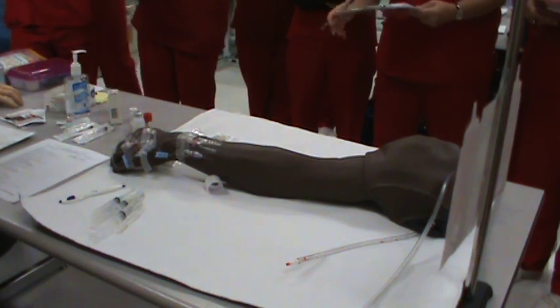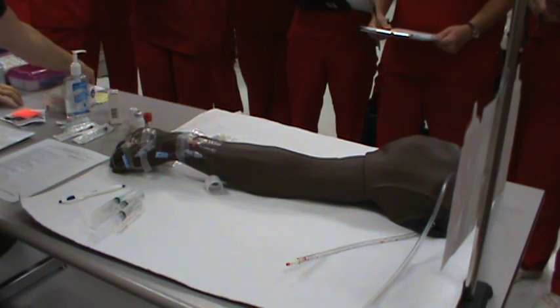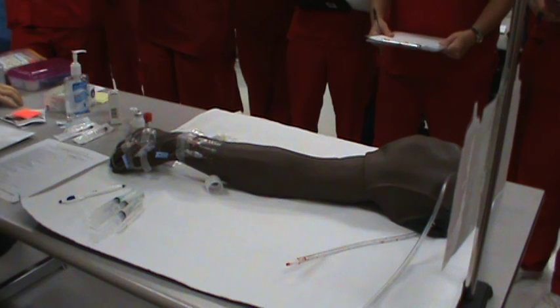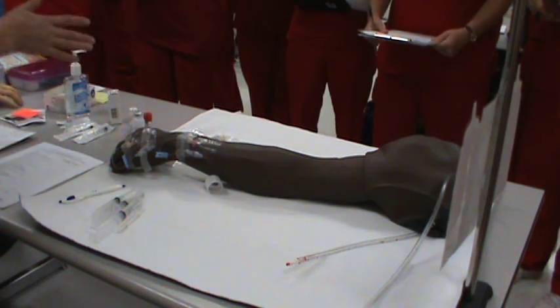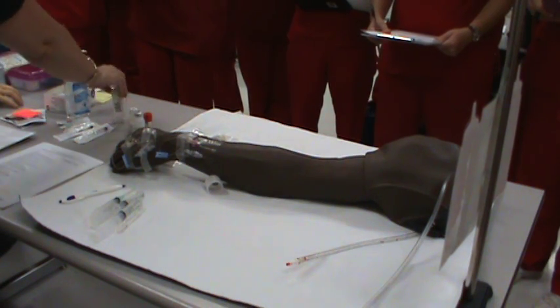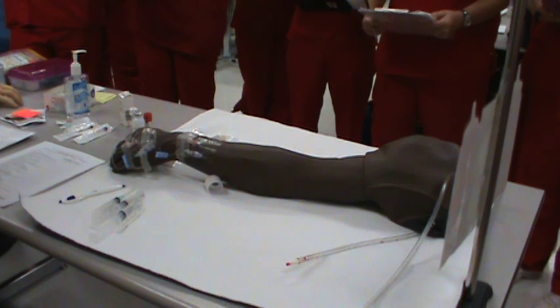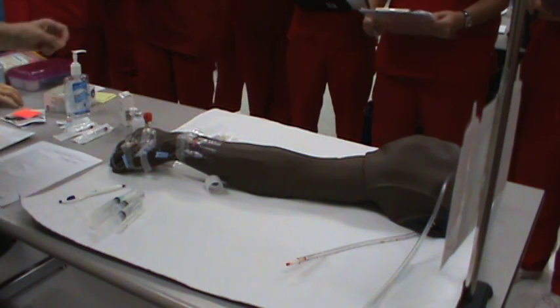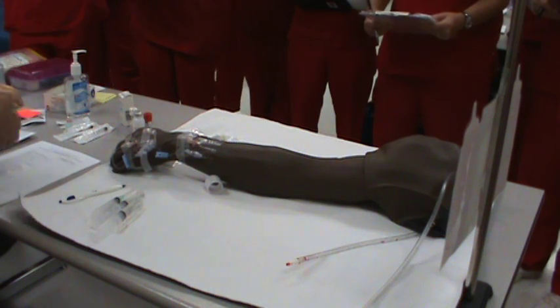Y'all know what this is? I probably won't have that during testing, but I'll have these and you can write the same information. So verify that and verbalize that your medication is compatible with your IV fluids. As you're saying this, I'm going to be checking it off. So go through it. That's how you practice with each other.